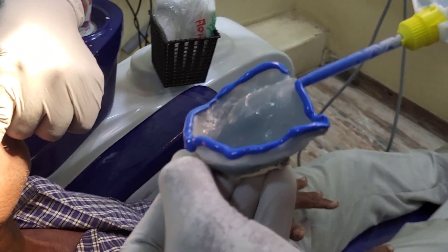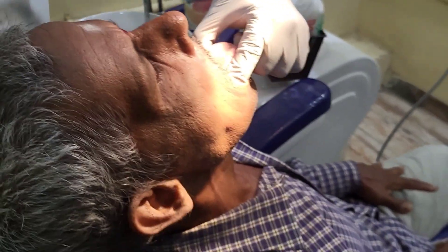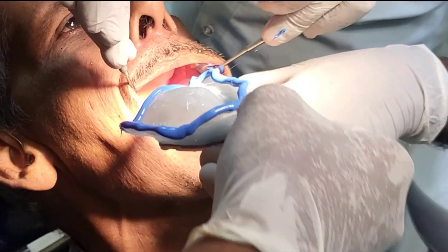We are applying the putty in the maxilla also. Since it is a BPS border molding procedure, it will be a closed mouth impression technique.